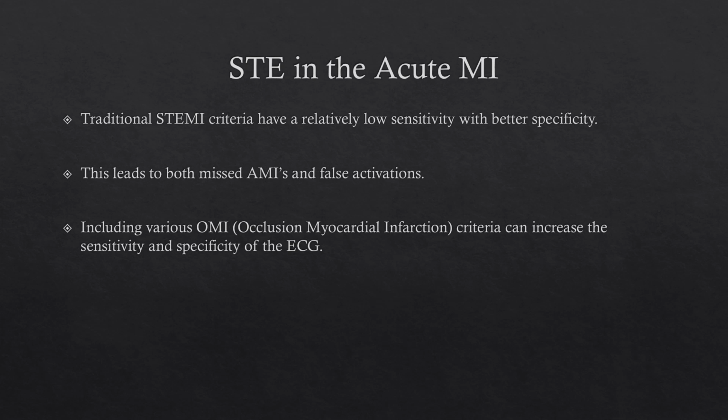The problem arises when you have that patient who presents with ACS-like symptoms and you're very concerned that you may be dealing with that occlusive myocardial infarction, so a complete or near complete occlusion. If you do not have ST elevation, it's not overly sensitive and thus not a great rule out tool.